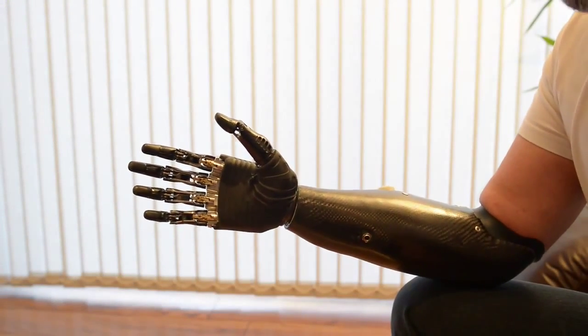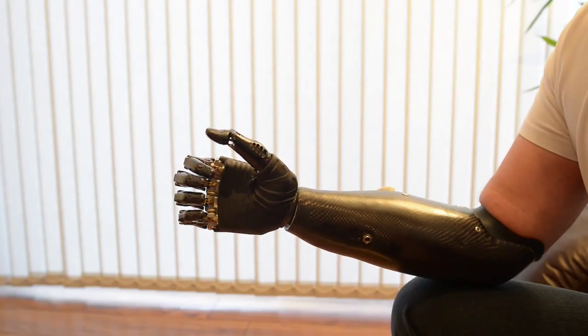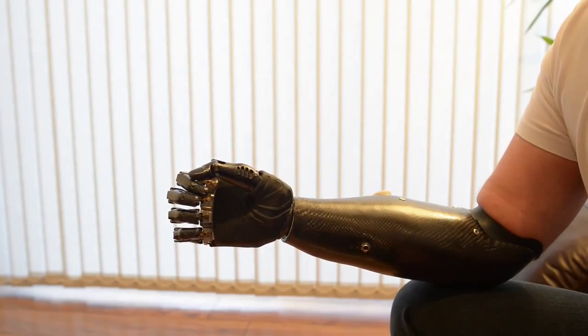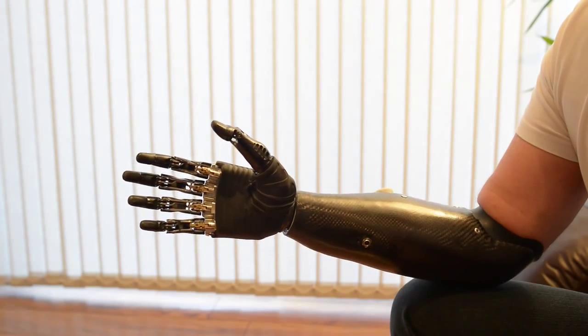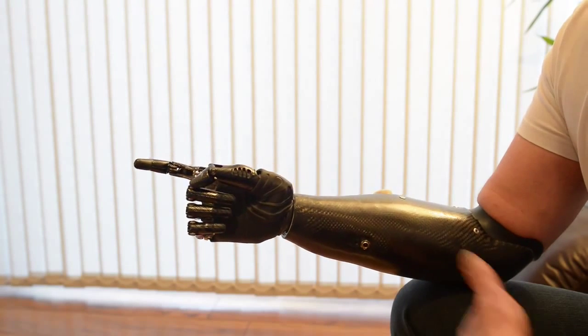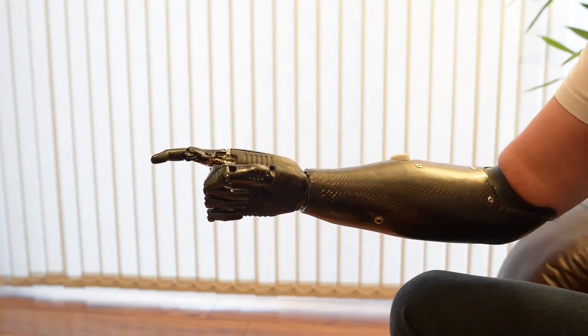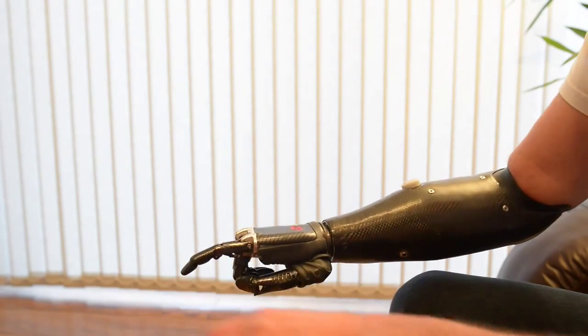This is the Be Bionic V3. This is key grip. This allows you to hold credit cards, bank cards, car keys, etc. And now move to a point — pretty self-explanatory. This one will allow me to type on the keyboard.